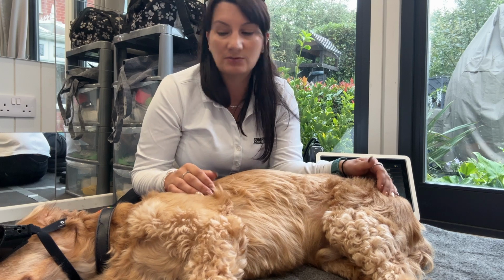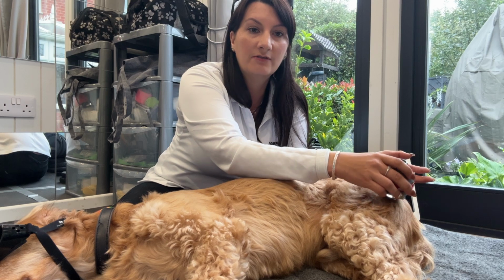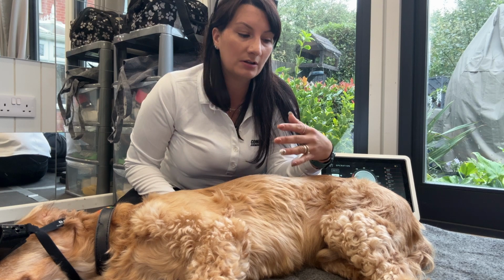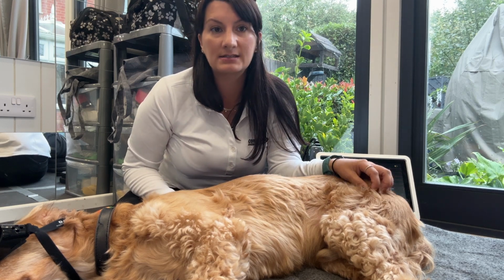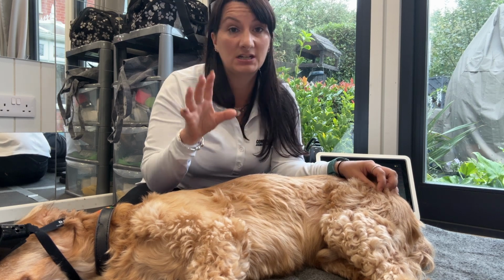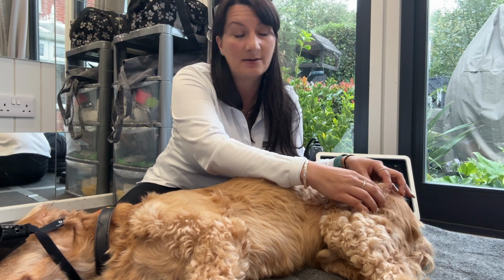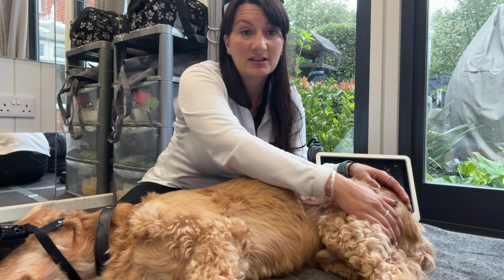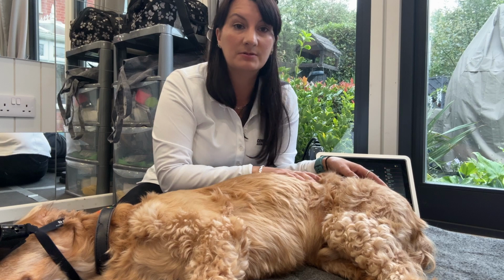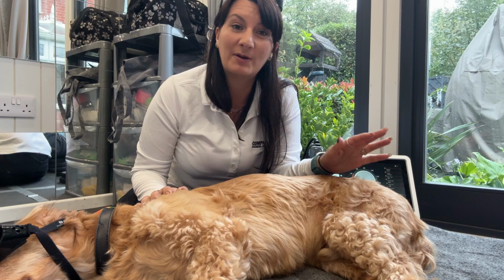So for me, it's not just about getting my laser and circling around that hip joint, or just doing point to point around that hip joint, because actually there's so much more going on here. And this is one of the reasons when I'm talking to people about cases, maybe they haven't had as much success with a case, quite often it's because not enough tissue is being saturated. So there's no point in just focusing around that hip joint. Yes, that may be the source of the disease, but there's so much more going on in the surrounding muscles, up in that groin, all the way up to my lumbar sacral, and it doesn't just sit there. We all know about compensation.